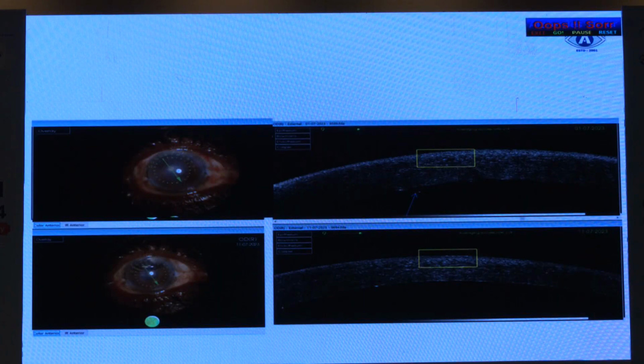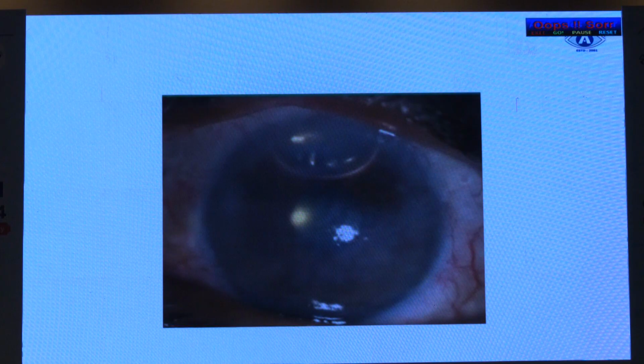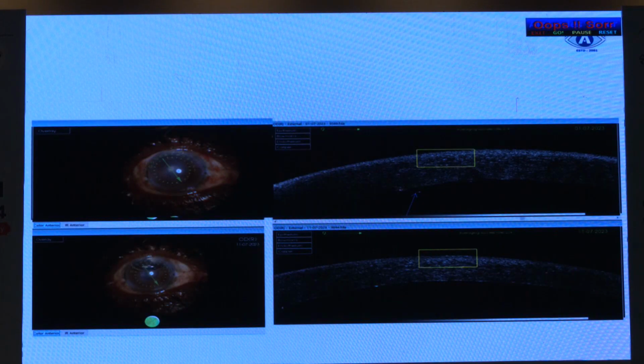This is just in routine cataract surgery where you can use this. This is a case of hazy cornea post-cataract surgery where you can't see the Descemet membrane detachment. On doing an ASOCT, you can see there is an undulating membrane over here, and putting an air tamponade opposite to that clock arc is just going to resolve the Descemet's detachment.